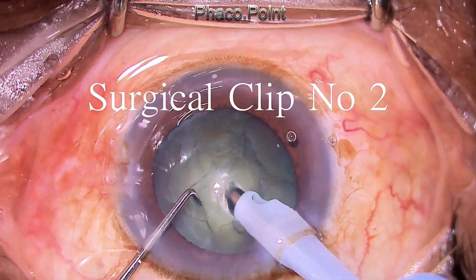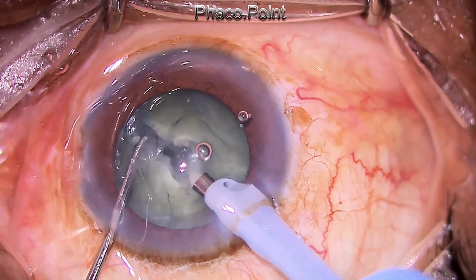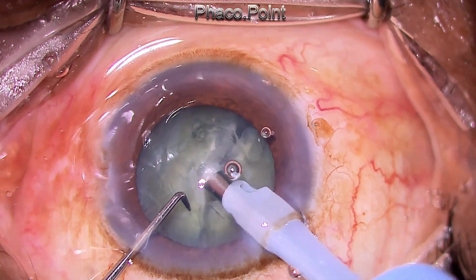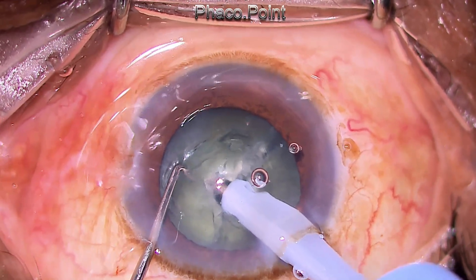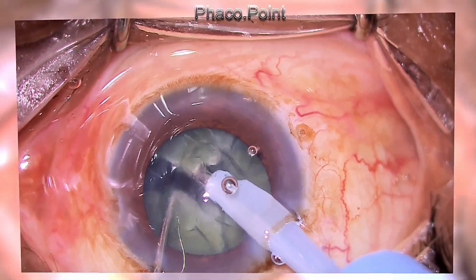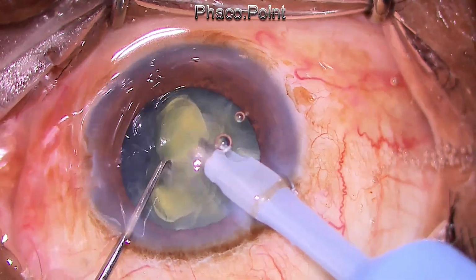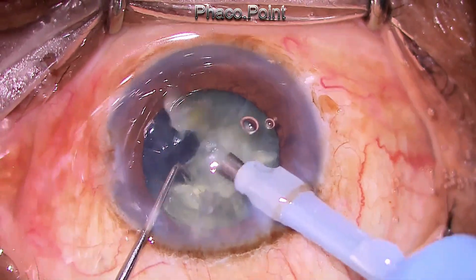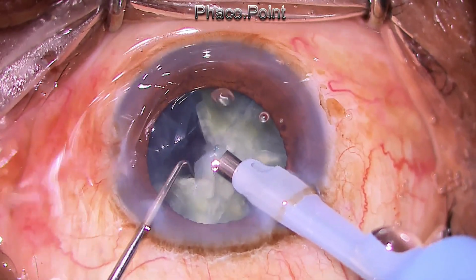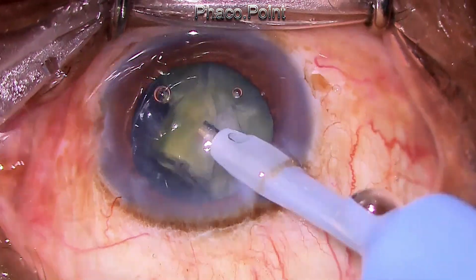Now let's move on to the second clip, and this is a surgical video of my own surgery of a similar grade of nuclear sclerotic cataract, where I'm using a superior approach and I'm using the direct Phaco chop technique. The settings are more or less the same. I'm also using a Phaco power of just 30% and a vacuum of 300 millimeters of mercury, except that I'm probably using a multiburst mode or a hyperpulse mode instead of a pulse mode of Phaco.